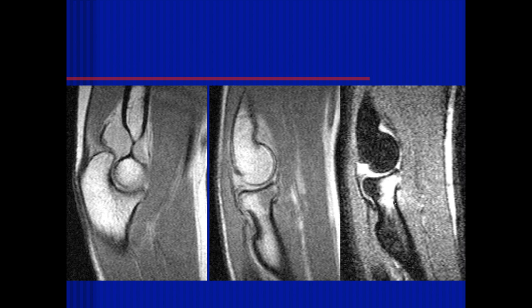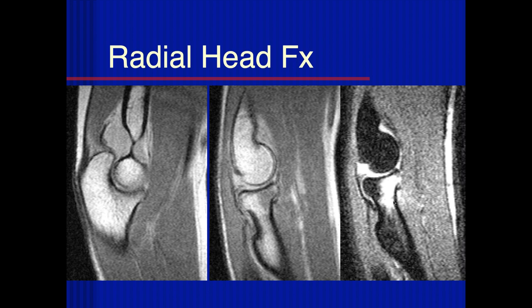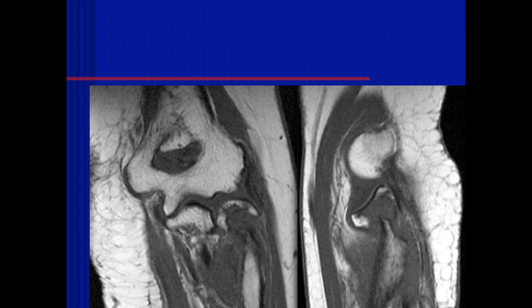All right, so here I can see some increased signal within the proximal radius. I don't see any cortical breakthrough, but I'd want to look at the additional sequences. Okay. Intramedullary bone edema without cortical breakthrough and without displacement is treated conservatively, as opposed to this one, Ashu.